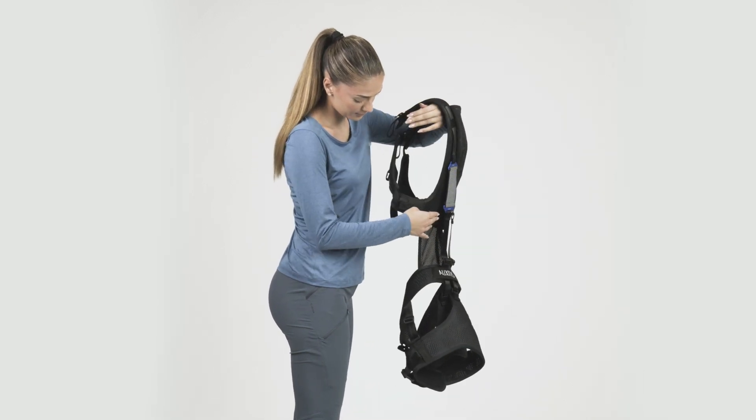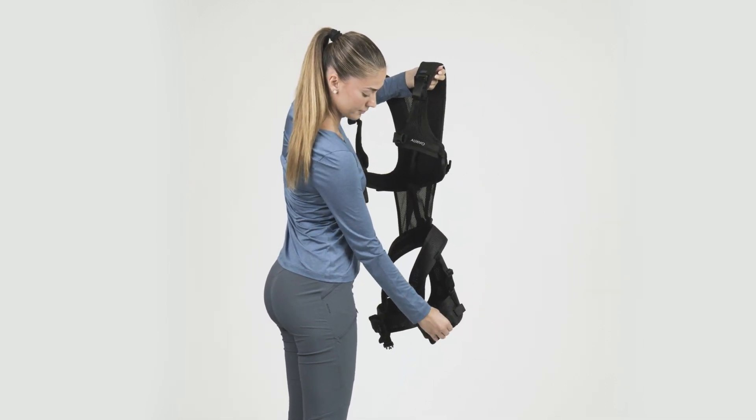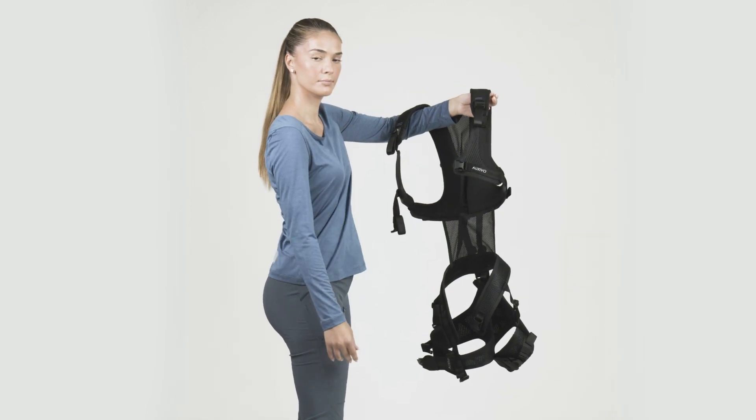There is one adjustment strap in the front of the vest, two at the back of the vest, one at the hip belt, and one at each thigh cuff. Open and loosen all buckles and straps to make it easy to put on later.